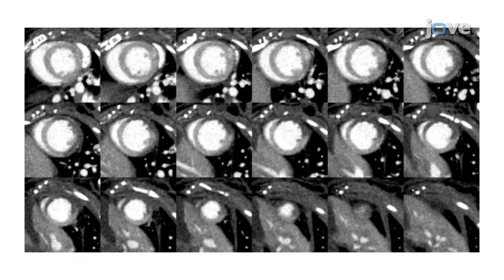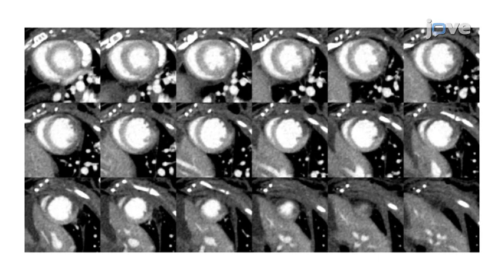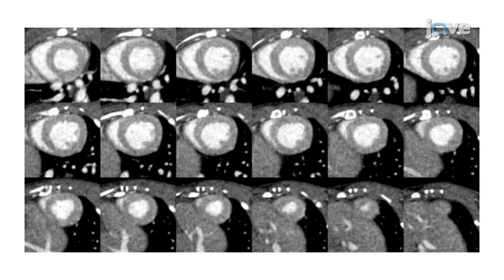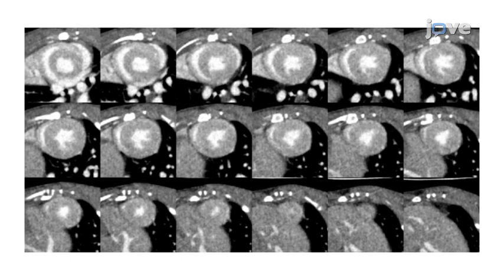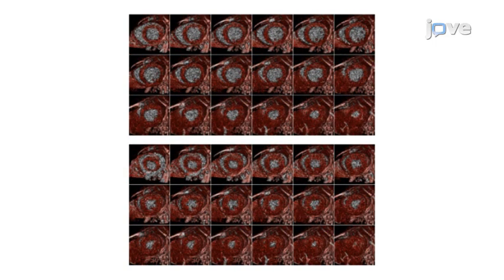Here, representative blood pool short axial end diastolic and end systolic cross sections of a mouse heart with a myocardial infarction are shown. Short axial end diastolic and end systolic cross sections of a mouse heart without myocardial infarction exhibit excellent left ventricular cavity delineation with little background noise. Note how the areas of contrast rarefaction, corresponding to the myocardial infarction, were well demarcated on the short axial images of the mouse heart subjected to left anterior descending coronary artery ligation, but not in the sham operated animal.